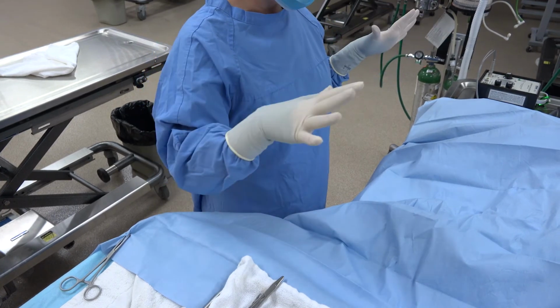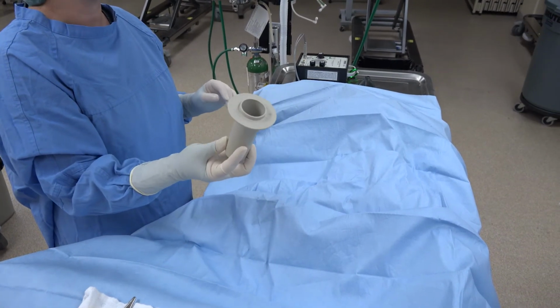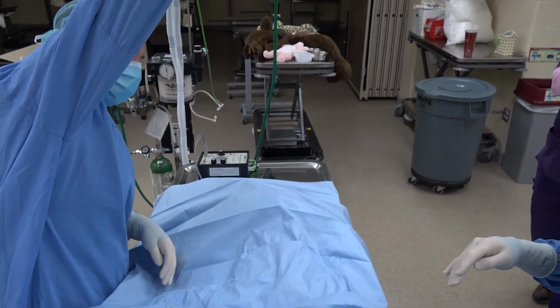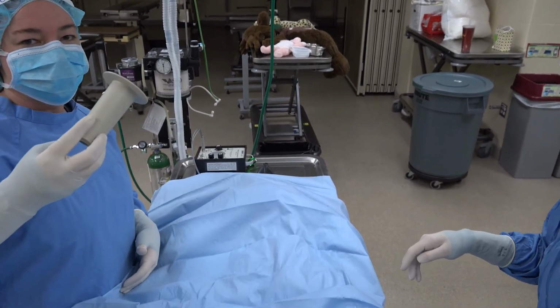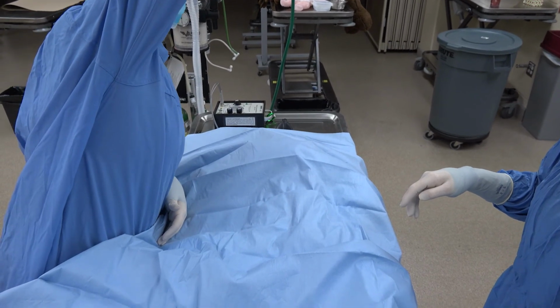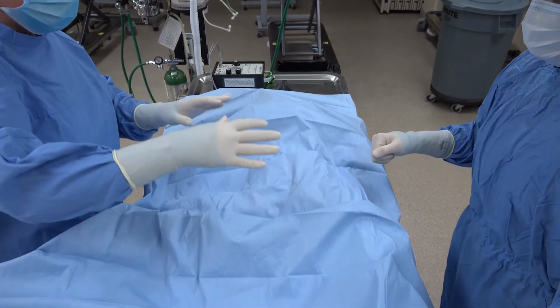All right, now that we've got the whole table covered, I can now use my light handle and put my light handle up. Now, you can see as I put this light handle up, my stomach is touching the table. That's okay because I have this big sterile drape right here, and so it doesn't matter that I'm touching the table with my belly, but that's why we wait to put the light handle on until after the table's completely draped, and I can arrange that.